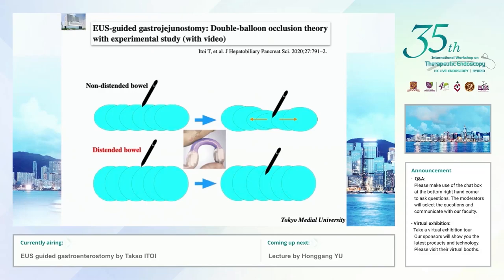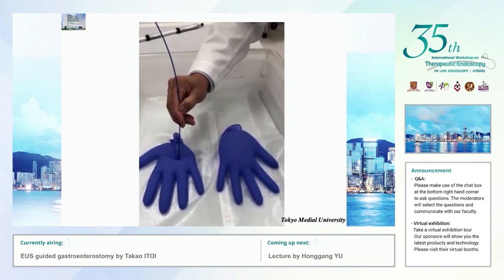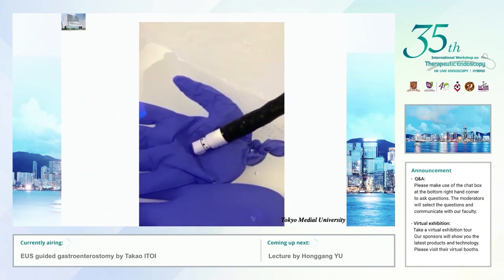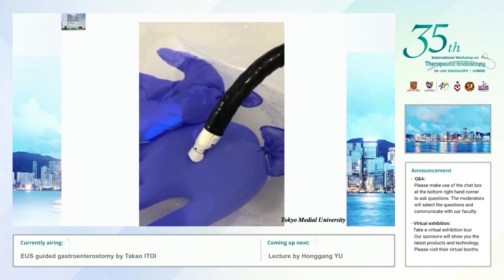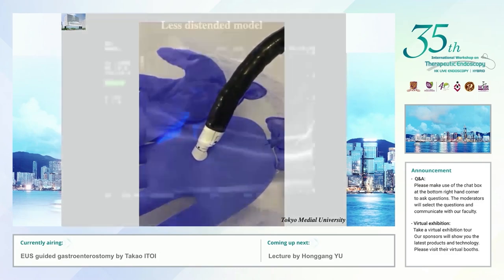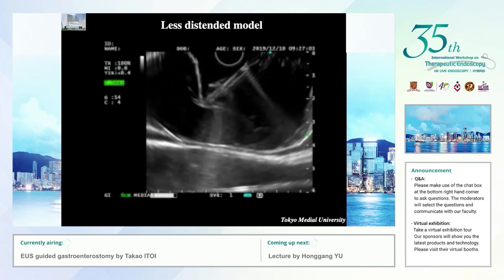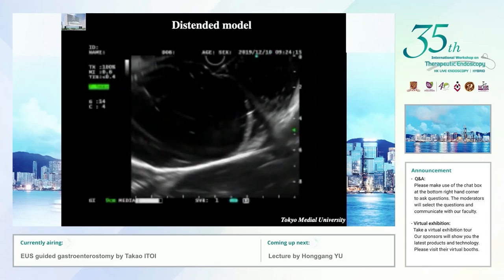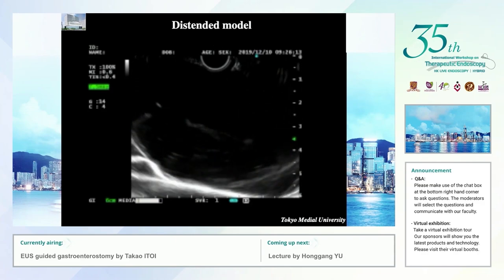I propose the double balloon occlusion theory. Next, I'd like to show this theory using an experimental study. A small amount of water in the plastic glove provides a lower tension than a larger amount of water. You can see the EUS imaging. In the non-distended model, the needle couldn't penetrate the plastic glove. In contrast, in the distended model, it could easily do that without any stress.